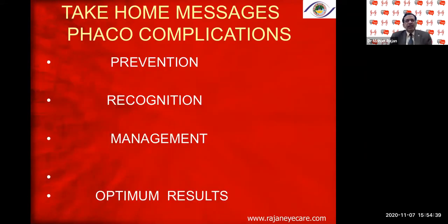The take-home message is, as far as handling phaco complications, I try to cover as much as possible. Prevention is better than cure.